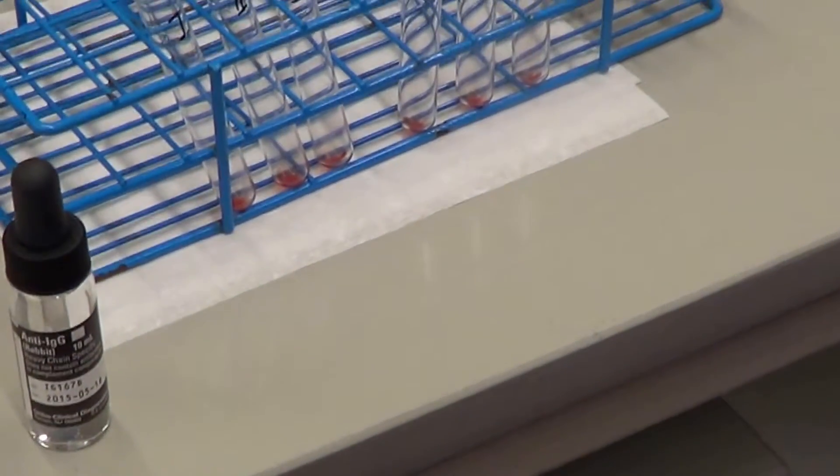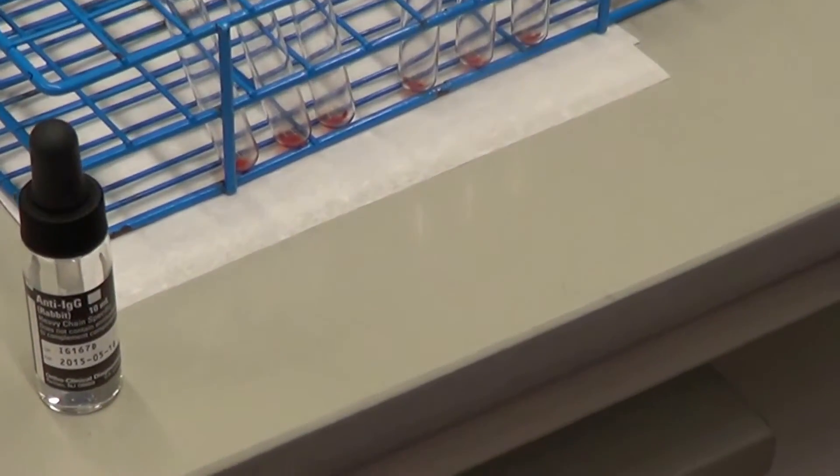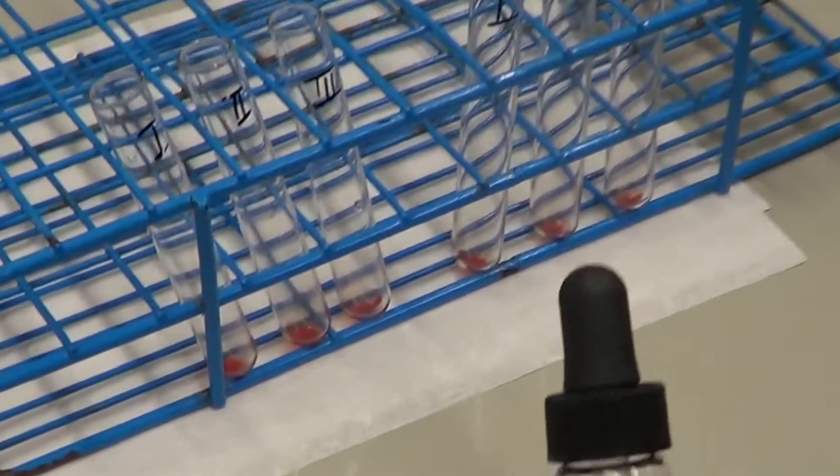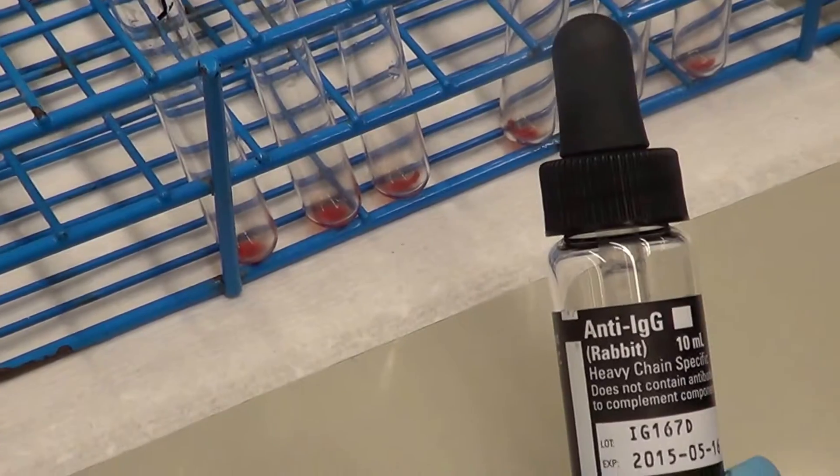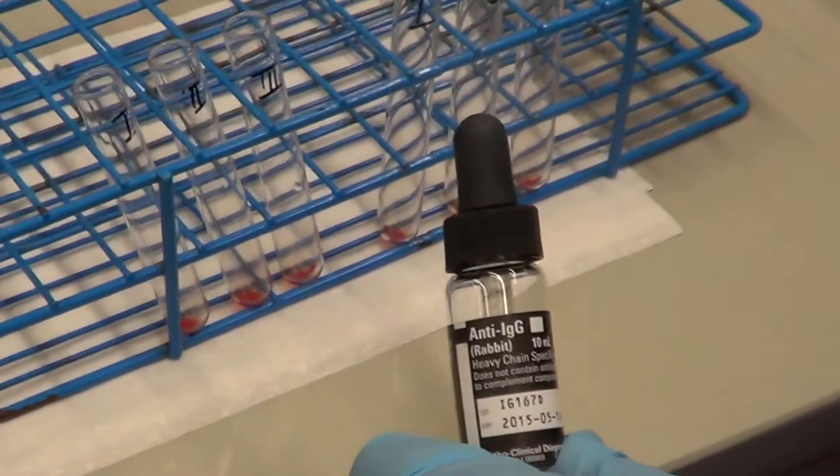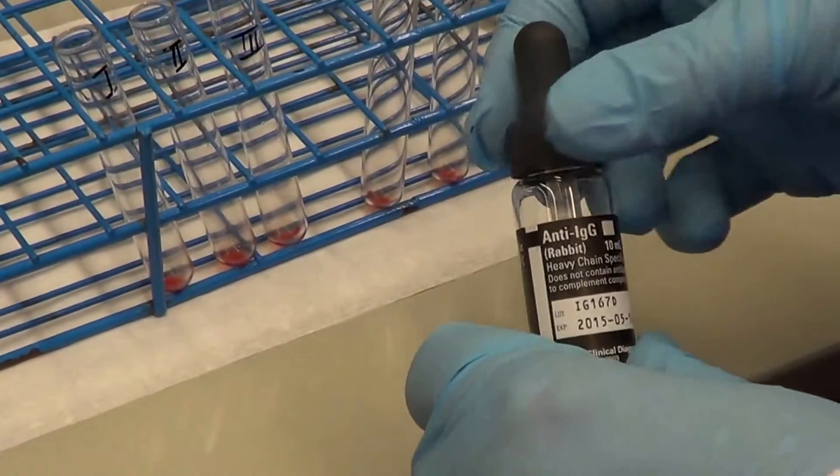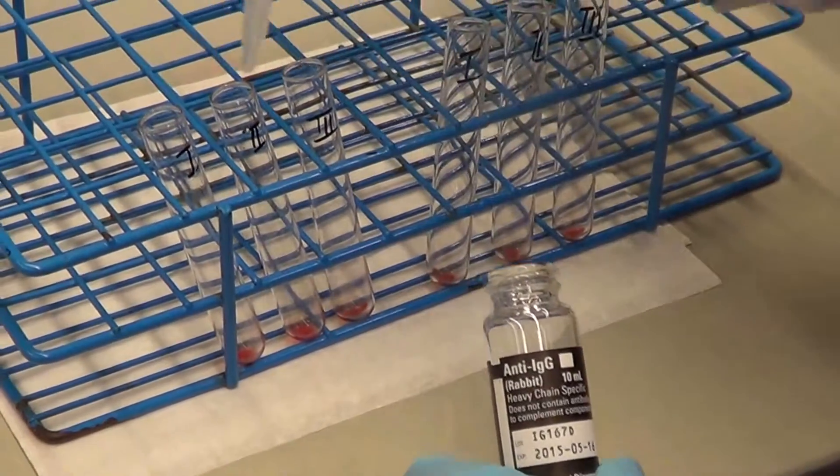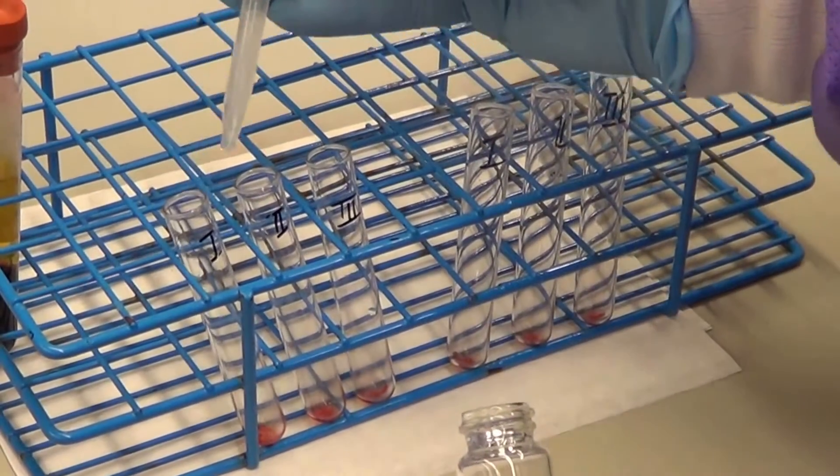The third phase of testing is the anti-human globulin test. At this stage, after we washed the cells and we removed all of the excess patient serum, we add two drops of our anti-human globulin. We are adding anti-IgG. We add two drops to each test tube.